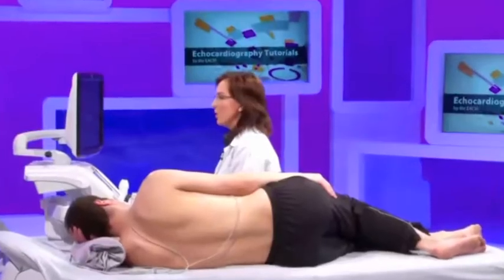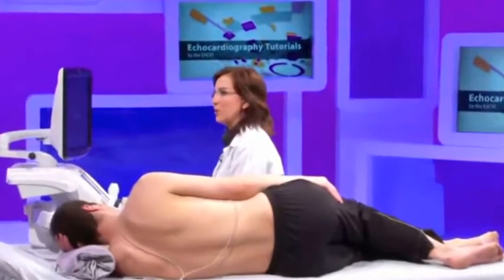For the echocardiographic examination of any patient with tricuspid regurgitation, you should be able to follow a certain sequence. First, you need to define the mechanism of regurgitation, then to assess its severity, to assess the consequences of the tricuspid regurgitation on the right heart chambers, and finally also to assess the pulmonary pressure.